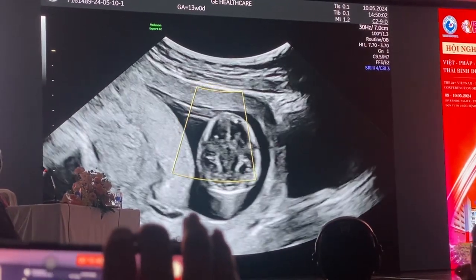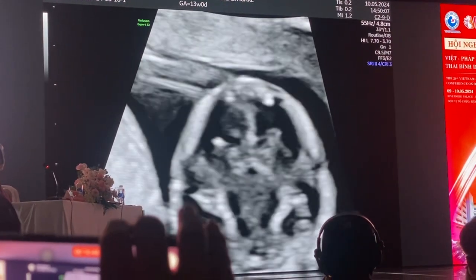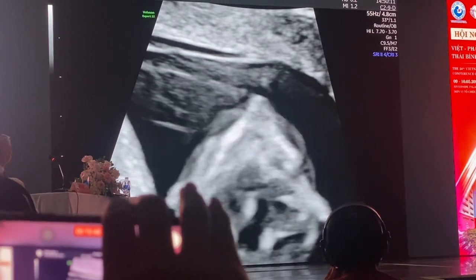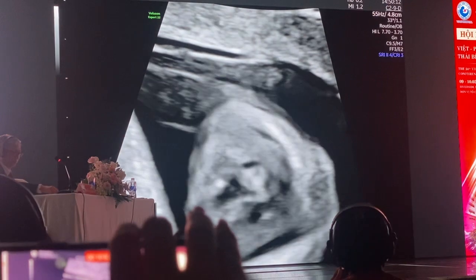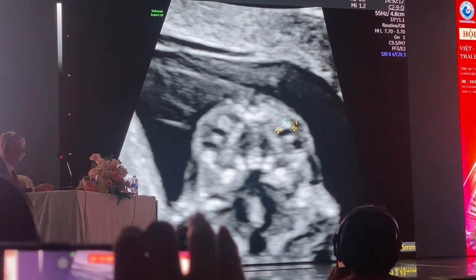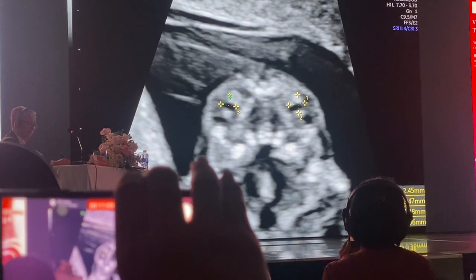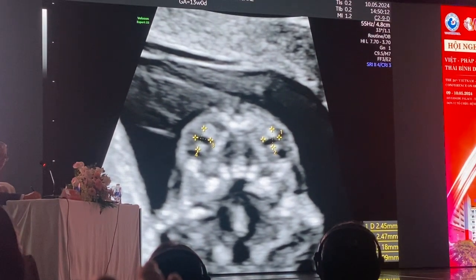So just try one more time to get a better image to show that to you. So there's the anterior horns, and there's moving up onto the orbits. You can see the lens within freeze. You constantly use cine loop in imaging because the baby moves so much. But this shows you the lens within the eye, and there's no cataracts. So it's important to seize the opportunity of looking. I'm only measuring this to show you. I don't measure the lenses normally.